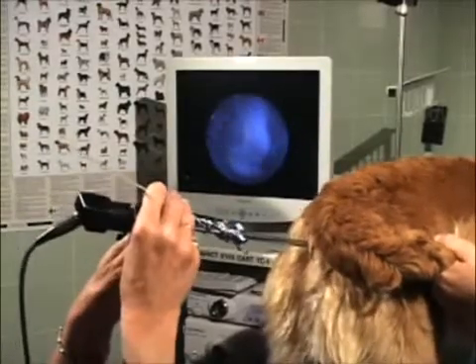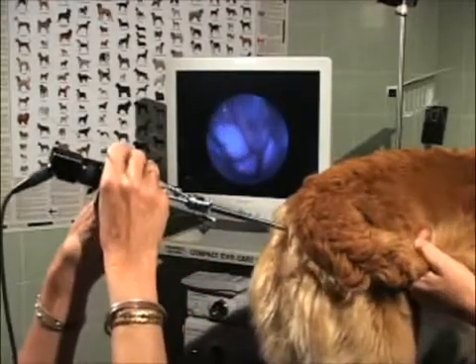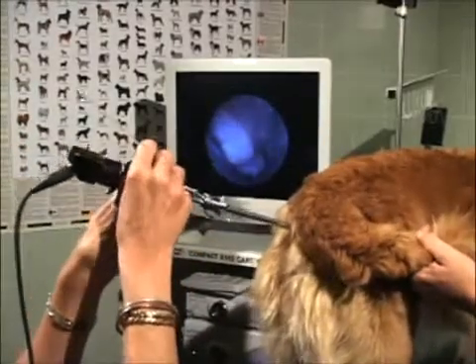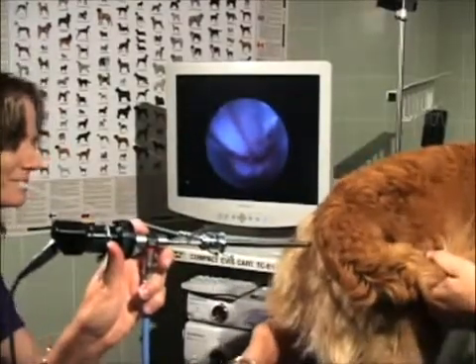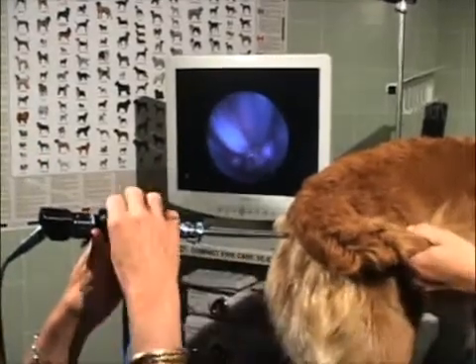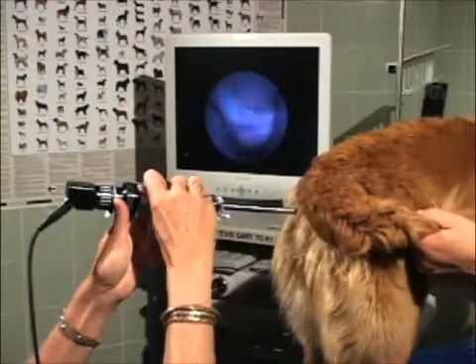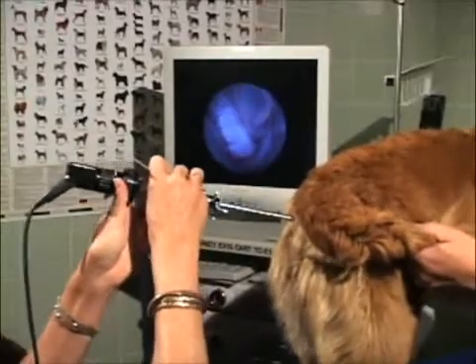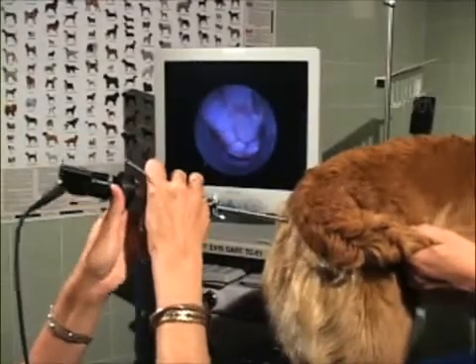The scope is passed cranially. Its rigidity permits negotiation through the vaginal folds. The dorsal median fold is used as a landmark. At the end of the dorsal median fold, a narrowing at the paracervical region creates the false cervix, which appears as a horizontal slit. The actual cervix is cranial and ventral to this.